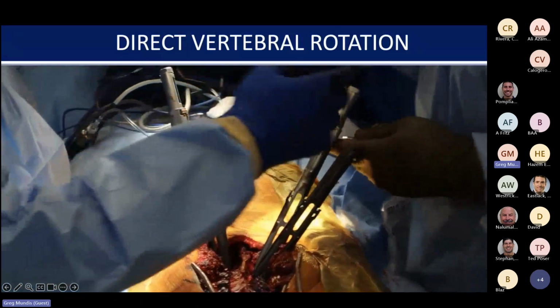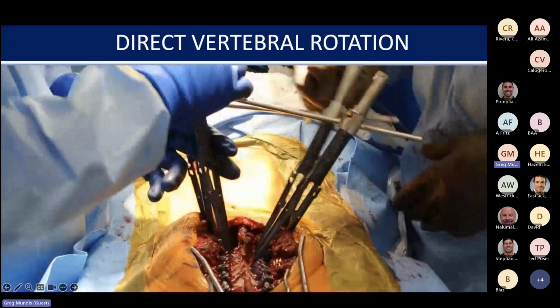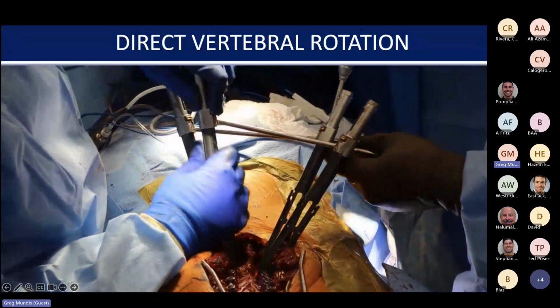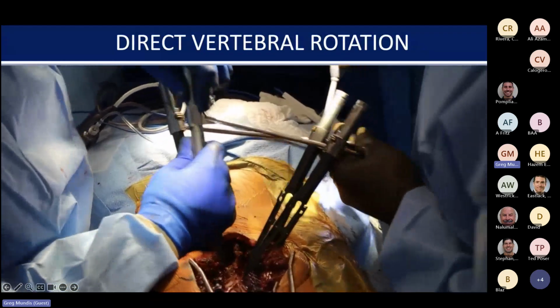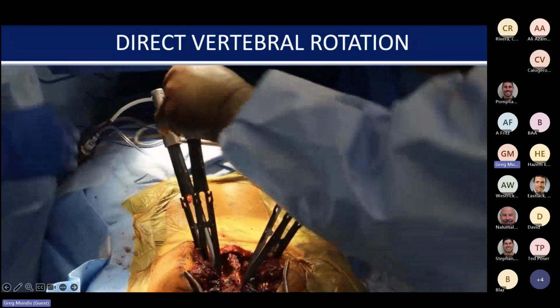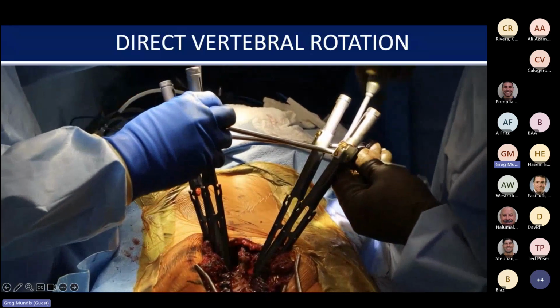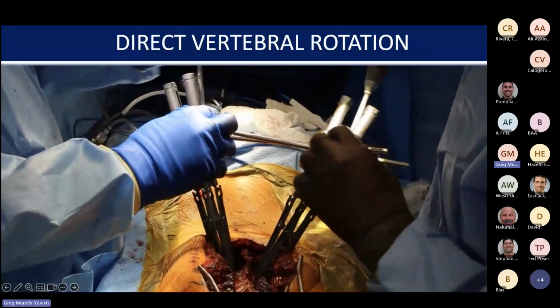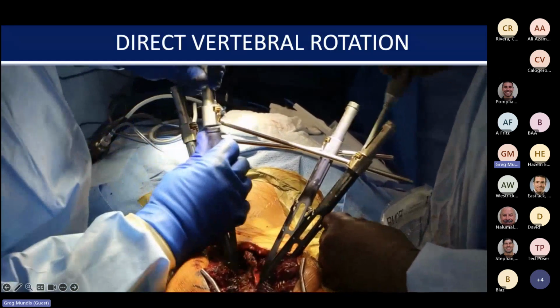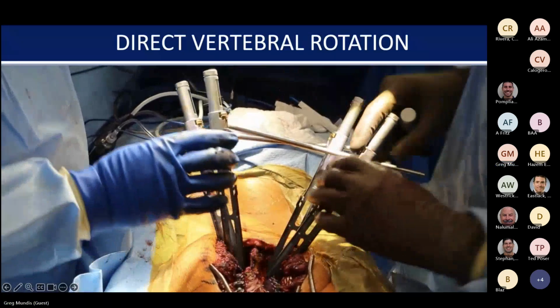To do this, you have to find your neutral vertebrae, and you're going to lock the neutral vertebrae in place. The towers on the far end of the patient, or the caudal side, are at the area of the neutral vertebrae. So what you're doing is triangulating the screws. You're connecting them by the vertebral body anteriorly, and then connecting them posteriorly with these bars, making the two screws into a single unit that you can then lever off of.